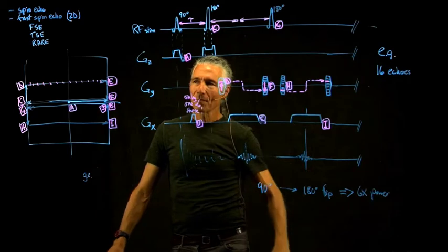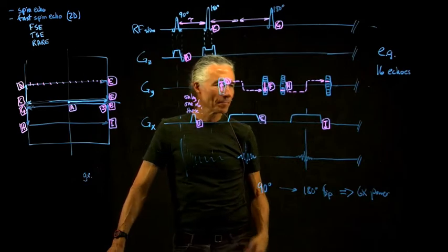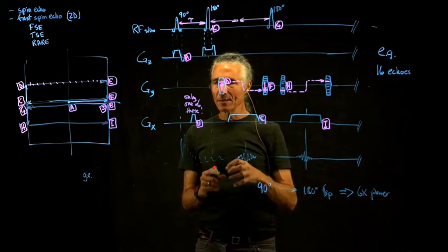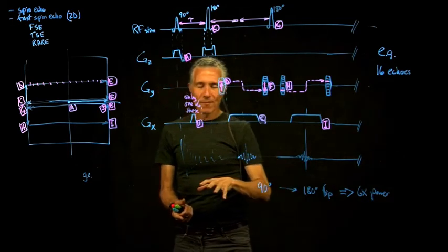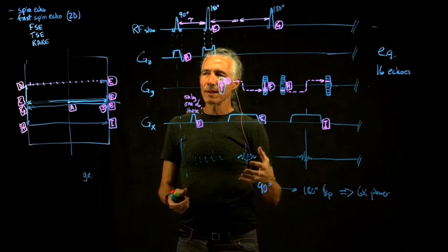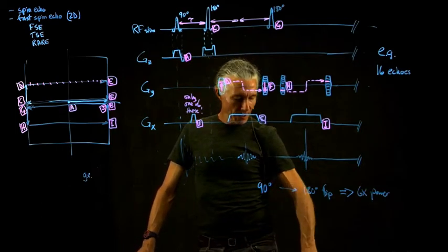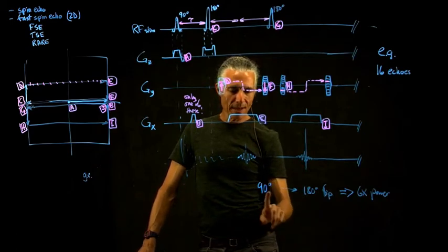And there's a limit to how much you can heat up the subject. You don't actually want to warm them up more than about a degree. And the scanner takes very careful record of how much RF power you've deposited. It actually directly measures it: if you put in an RF pulse, some of it will get absorbed, but the part that doesn't get absorbed will be reflected back. And so you can measure exactly how much RF power went into the sample, which is you.